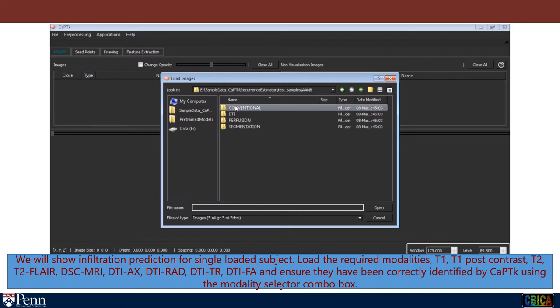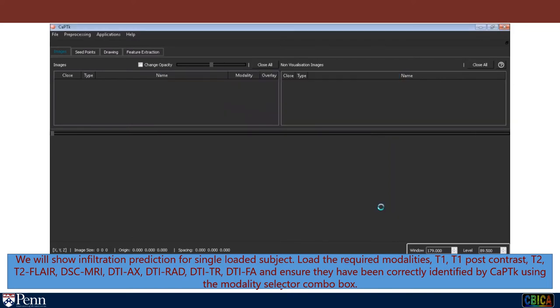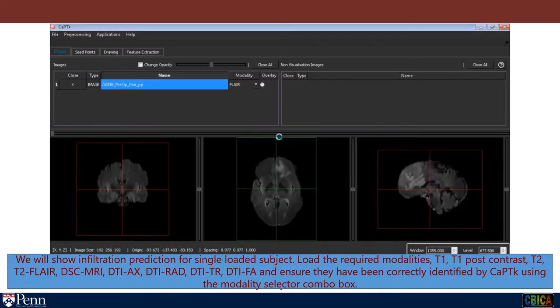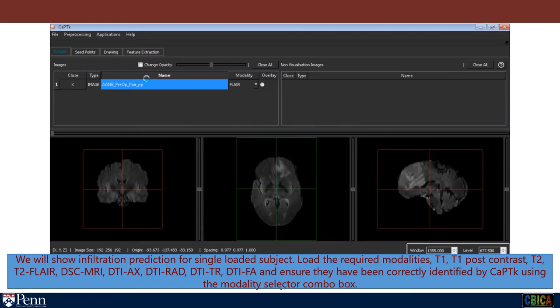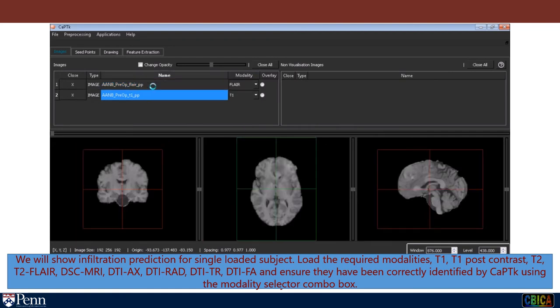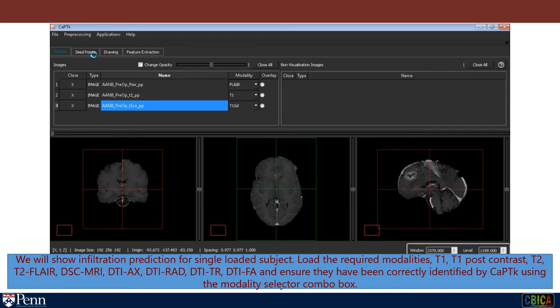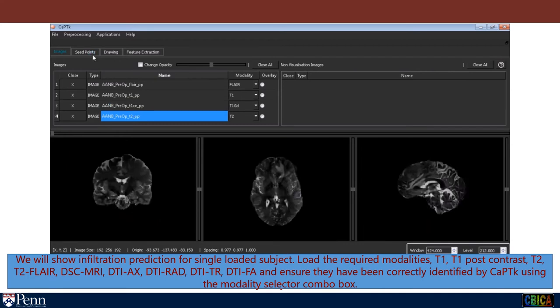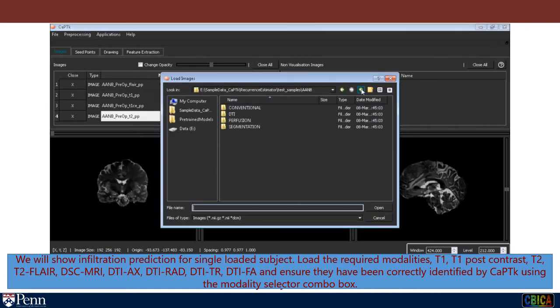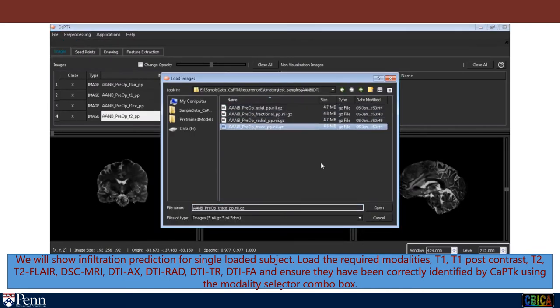Load the required modalities: T1, T1 post-contrast, T2, T2 FLAIR, DSC MRI, DTI axial, DTI radial, DTI trace, DTI fractional anisotropy — and ensure they have been correctly identified by CAPTIC-A using the modality selector combo box.